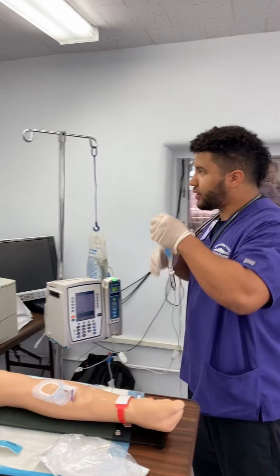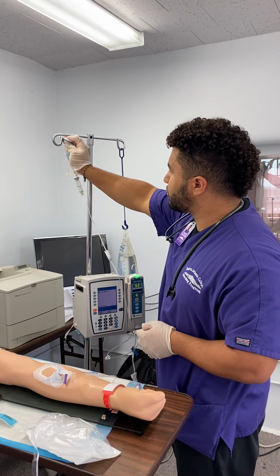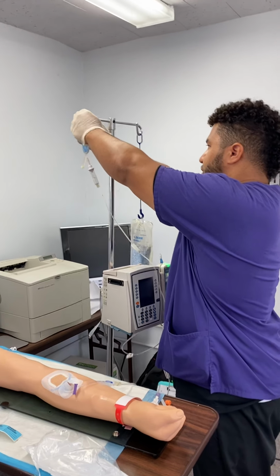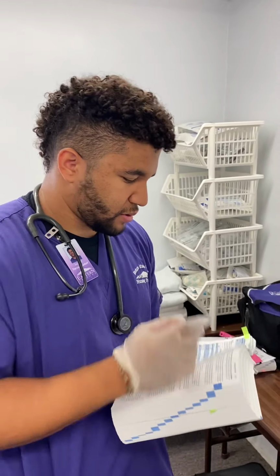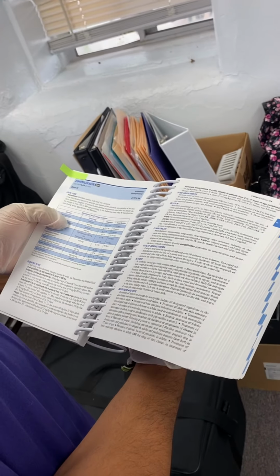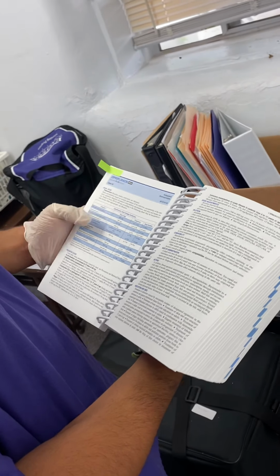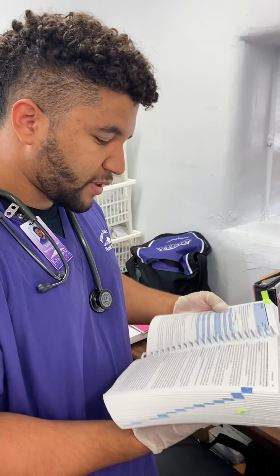Once it's spiked, you can go ahead and hang it, but before you start any of your infusion, you do need to double check in the IV book to make sure that the rate of infusion and medication is appropriate for the patient. So we can come over here to the IV book and make sure. So we have ciprofloxacin here. The parameters, the range from 200 to 400 is appropriate according to the following chart. We do have an order for 200, so we do fall within that range.